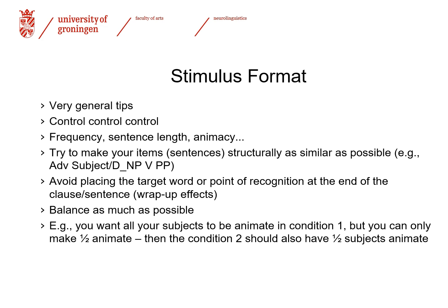We don't want to use a word in the experimental condition that is of much lower frequency than the word in the baseline condition, because that can contribute to the semantic demand that is necessary in order to process the sentence. So some of these variables that we need to control, or most of them, are actually determined by our research question and the design that we are employing.